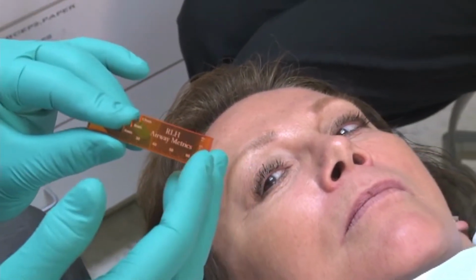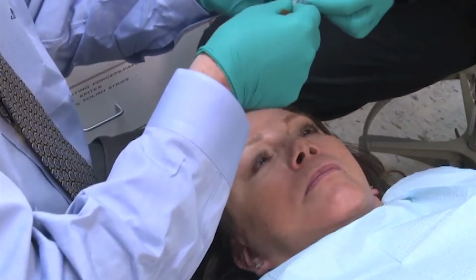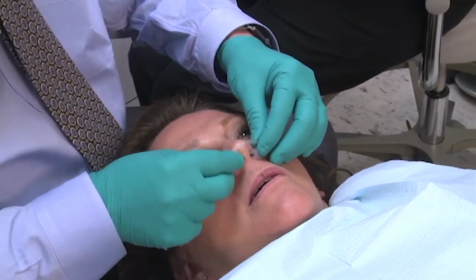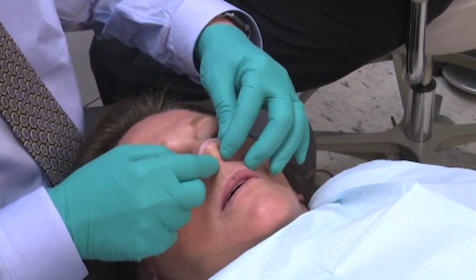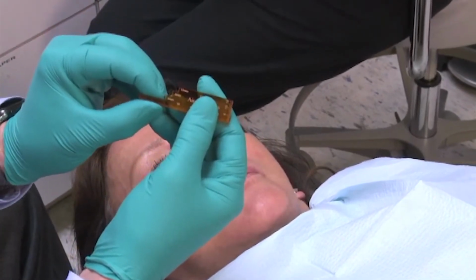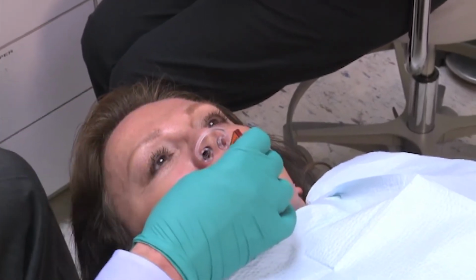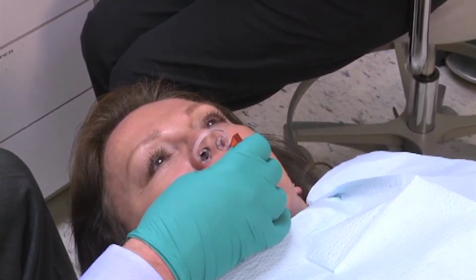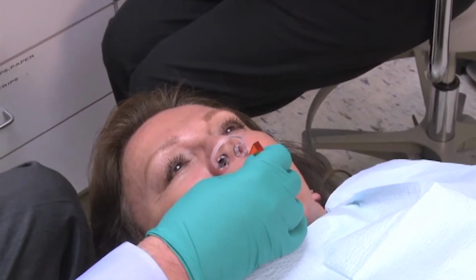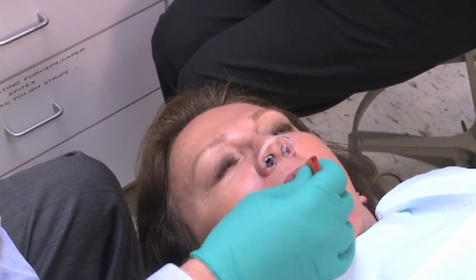So this is where the fun begins. Tammy, let's try our nose cones, and this is just an option for assisting and treating the patient, and see if we notice a difference with her snoring. So we're going to go back to the 4 millimeter step and see what happens. And close. Now try it, Kim. Big difference. Hopefully you all heard that. Try it once more. She can barely get any amount of snore in there. And open.